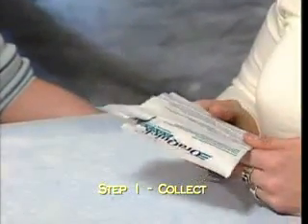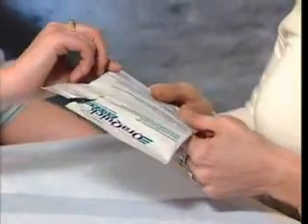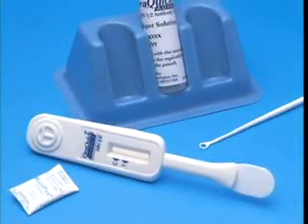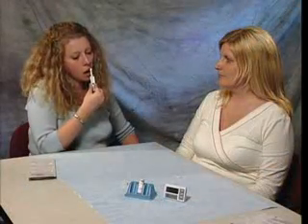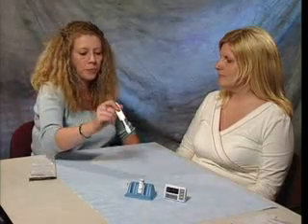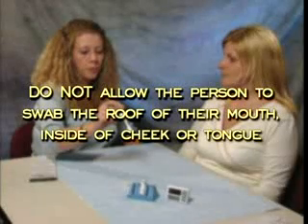Have the person being tested remove the test device from the pouch by the handle, making sure the flat pad is not touched. Check to see that an absorbent packet is present; if no absorbent packet is present, discard the device and obtain a new pouch for testing. Direct the person to place the flat pad above the teeth against the outer gum. The person should swab completely around the outer gums, both upper and lower. Both sides of the flat pad may be used. Do not allow the person to swab the roof of their mouth, inside of cheek, or the tongue.